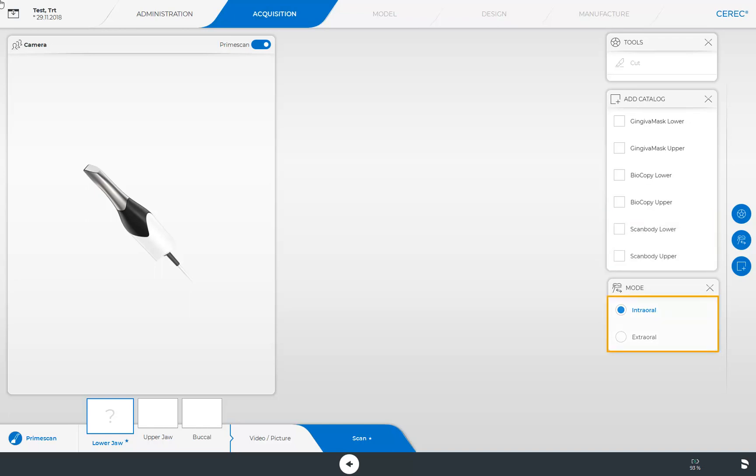In the last window, Mode, you can select between the intraoral and extraoral scan approach. Intraoral should be turned on for all intraoral scans. Extraoral is used for model scans.